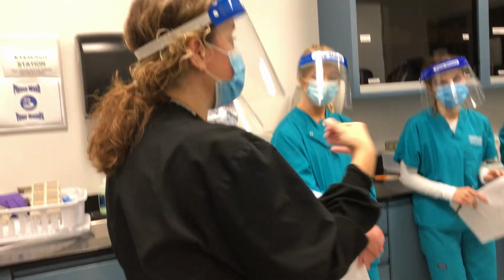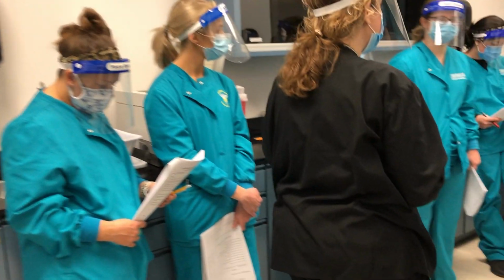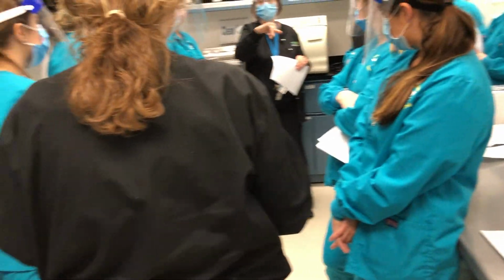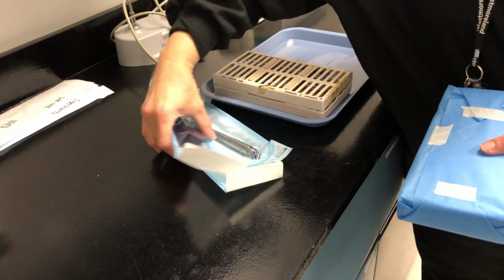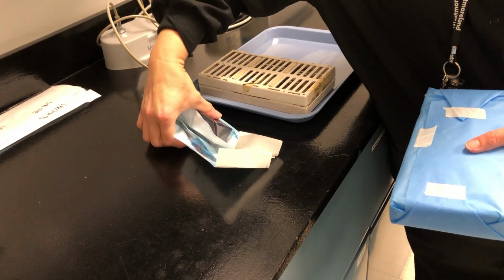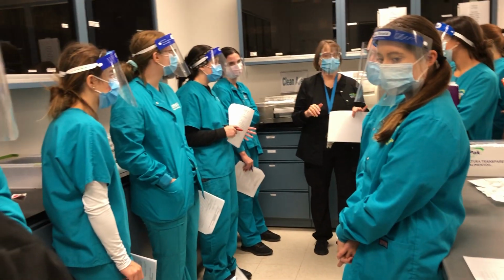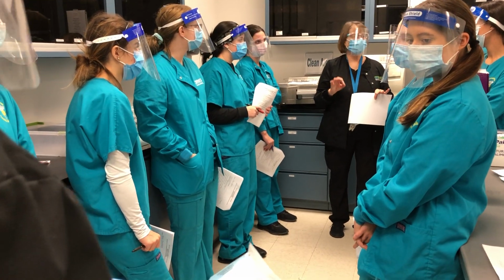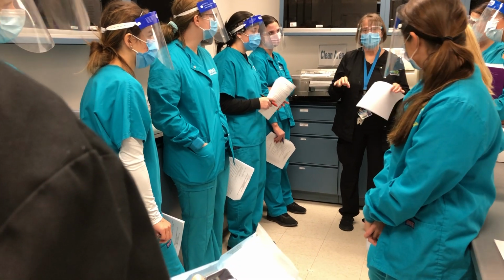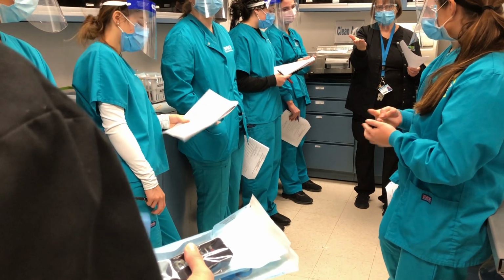But if we are going to go ahead and load the autoclave, I'll come over towards Miss Eustache and I'll show you this. You wanna grab your bags too? Sure. Because everything that's gonna go into the autoclave, you have the bags and you have the cassette. And all of them, how are you gonna tell if that cassette, when you're done, actually has gone through the time in the autoclave? Okay, does that tell you it's sterile? No. It does not. But that we use that. So with those cassettes, we put them in so we can see the tape.